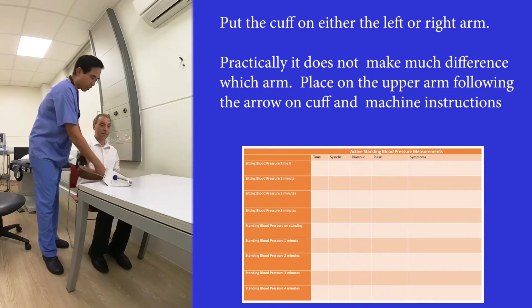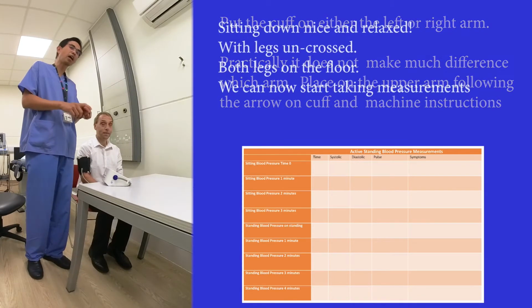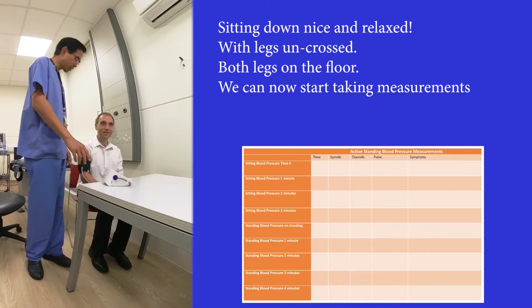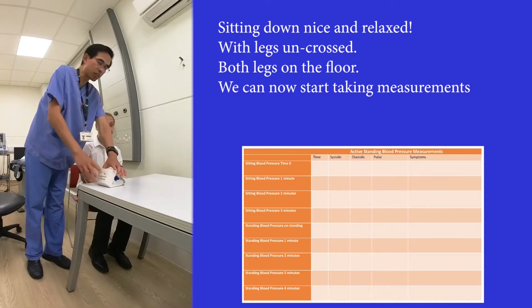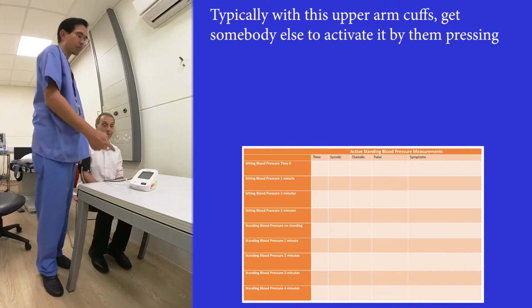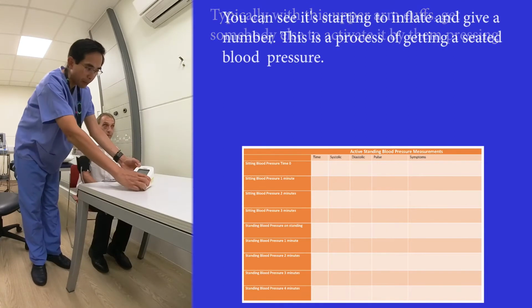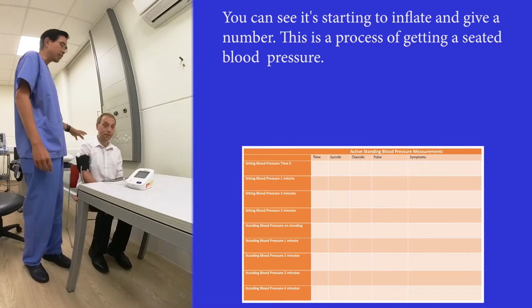Phil is now asked to sit down, nice and relaxed, with his legs uncrossed, both legs on the floor. And what we would then suggest is we start taking a measurement. Typically with these upper arm cuffs, ideally somebody else is pressing the button so Phil doesn't have to move his hand to reach out. You can see it's starting to inflate and give a number. This is the process of getting a seated blood pressure.